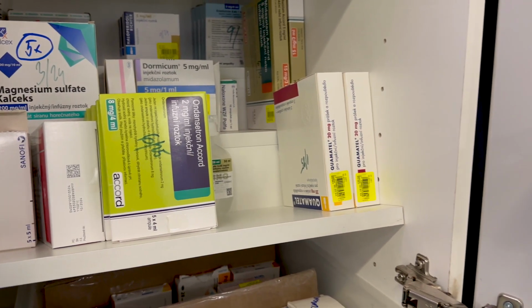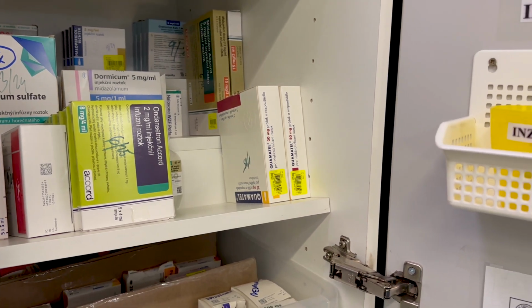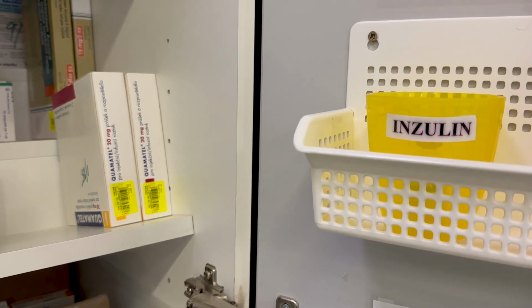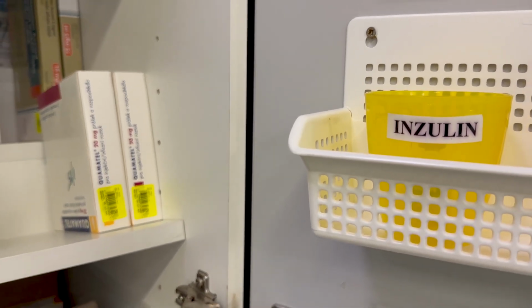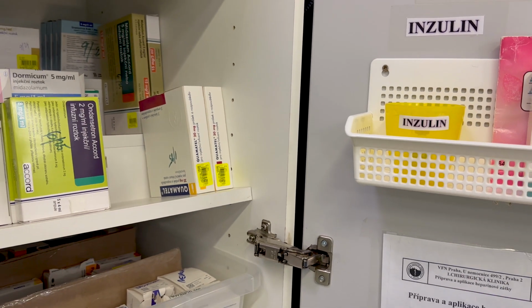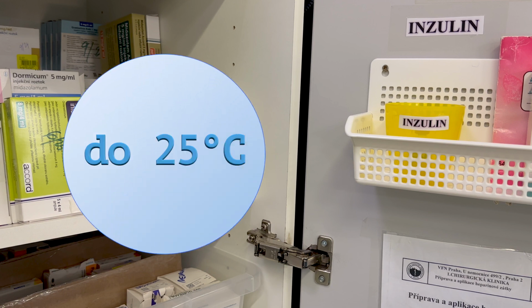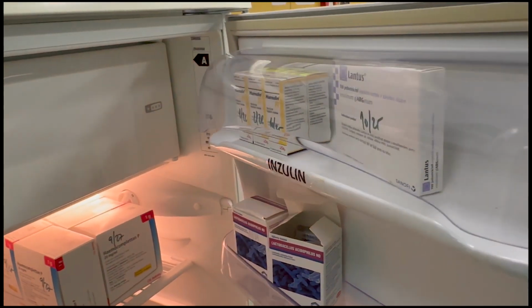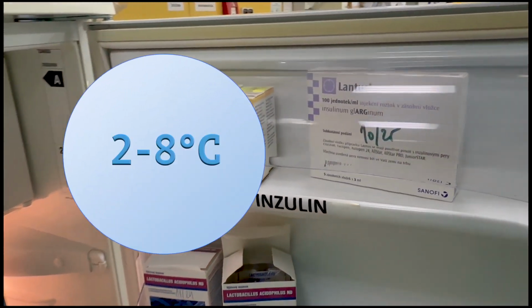Insulin is considered a high-risk medication and must be stored separately from other medications. All insulin packaging, whether unopened, partially used, or insulin pens, must be protected from light. Opened insulin packages should be properly labeled with the date of first use and stored at room temperature between 5 degrees C and 25 degrees C. Unopened insulin packaging should be stored between 2 degrees C and 8 degrees C.